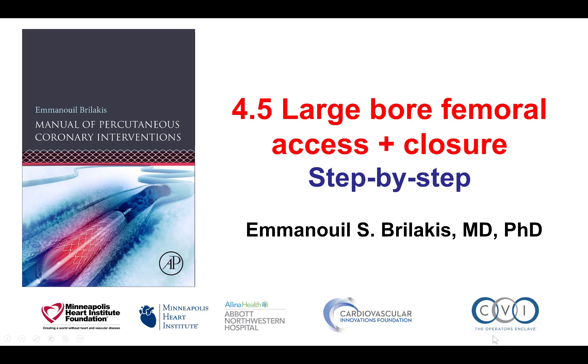Hi, this is Manos Brilakis and this is video 4.5 for the Manual of Percutaneous Coronary Interventions. This video provides a step-by-step description of how to obtain large-bore femoral arterial access and how to close it.